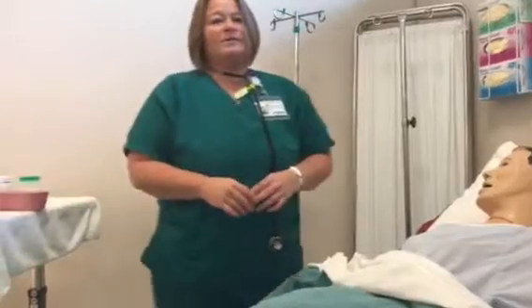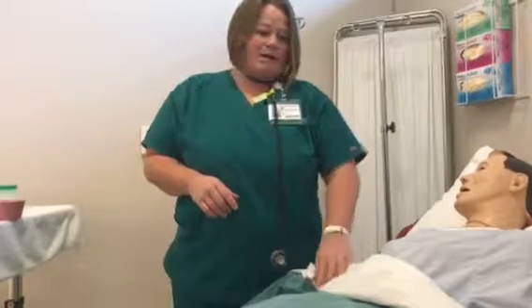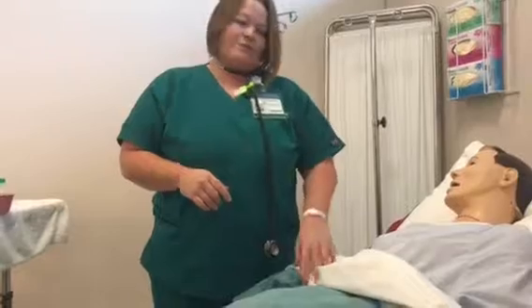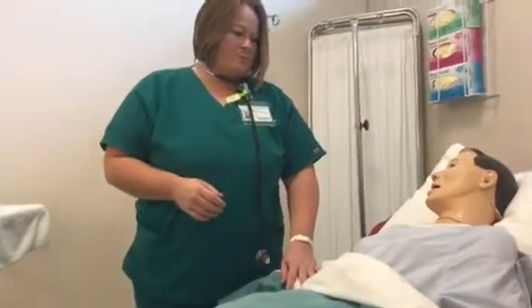When I come back in 30 minutes, I want to evaluate my patient's respiratory status. I'm going to check a blood sugar on them. And I also want to make note of their comfort, making sure that they're not nauseous or vomiting, that they're comfortable. I'm going to go ahead and wash my hands and document the procedure.